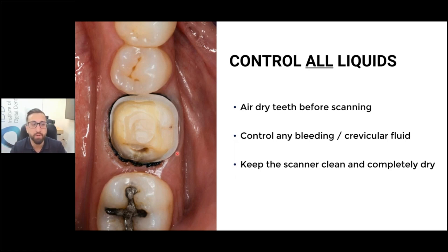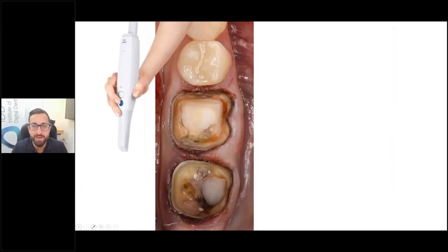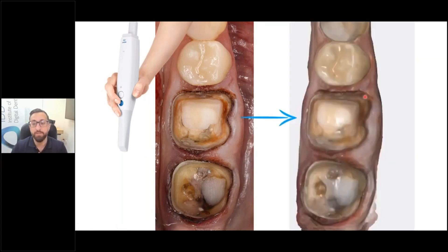Really, that's the key: just control the bleeding, crevicular fluid, and saliva. Then you get to a point where you have your preparations — everything is well controlled and you can clearly see the margins. If you look in a mirror or take a DSLR photo and you can clearly see the margins like this, the scanner is going to have no problem at all. When I do go to scan, I'll dry this a bit better. Always retract the soft tissues — I'm retracting on one side, the DA is retracting on the other side, and then you can scan very simply. And your lab will be much happier if you use retraction cord, because it makes their job a lot easier.